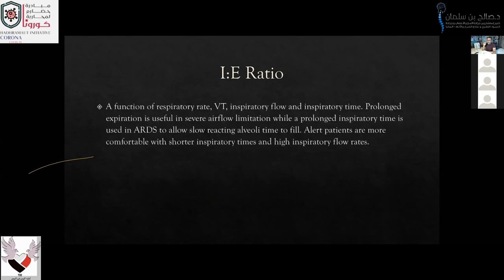Inspiratory-expiratory ratio is a function of respiratory rate, tidal volume, inspiratory flow, and inspiratory time. If you set the previous values correctly, the inspiratory-expiratory ratio will be set by itself and automatically measured by the machine itself. Prolonged expiration is useful in severe airflow limitation, while a prolonged inspiratory time is used in acute respiratory distress syndrome patients, COVID-19 patients, to allow slow reacting alveoli time to fill. Alert patients are more comfortable with shorter inspiratory time and high inspiratory flow rate.